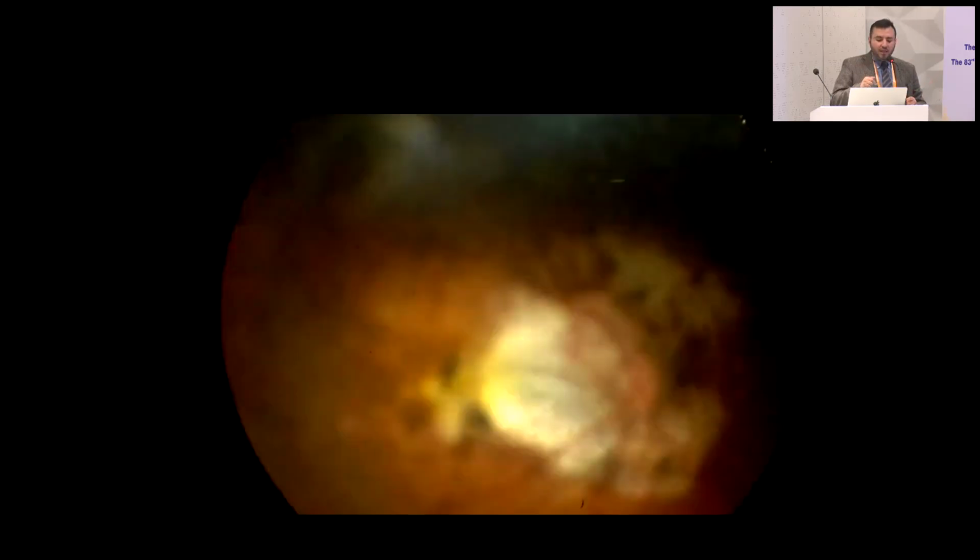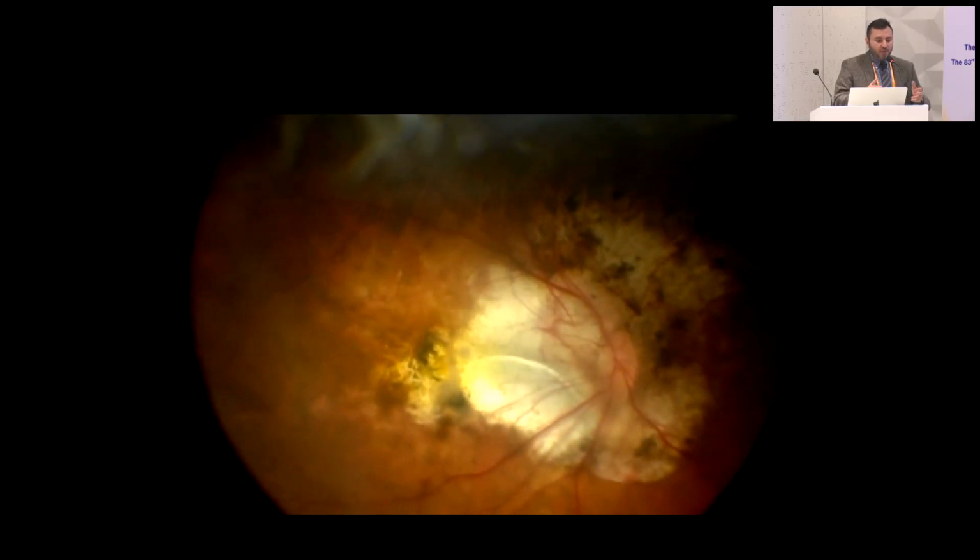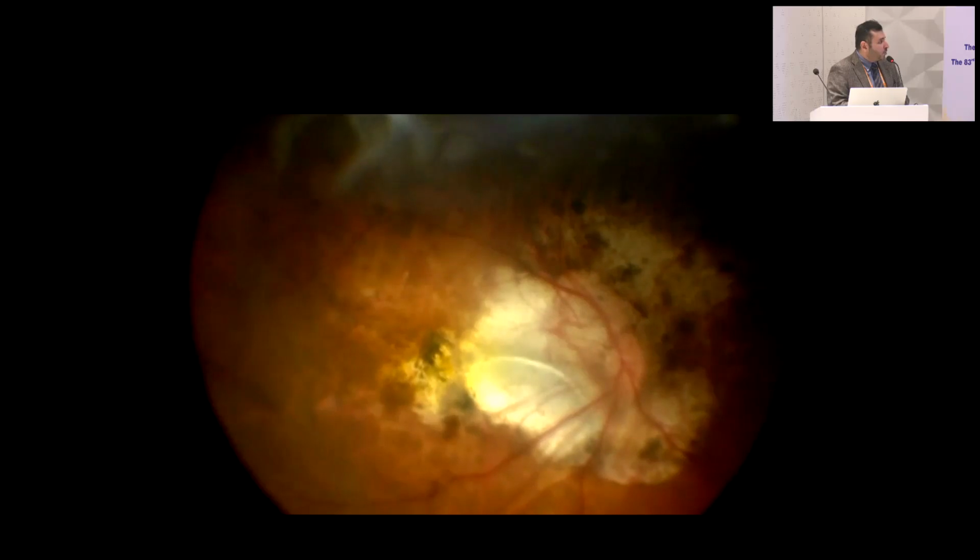This is the indentation effect of the buckle, and I'm using this indentation to move it to accommodate the staphyloma at the posterior pole and at the macular part, as we are going to see now. So moving the buckle and adjusting its place while putting the chandelier light. It's not a difficult procedure, but it's important to put it in the right way.